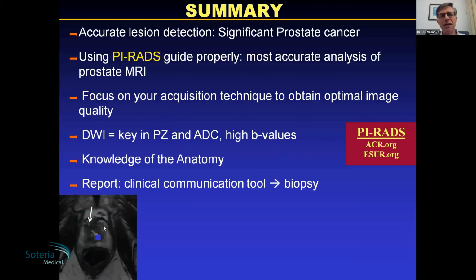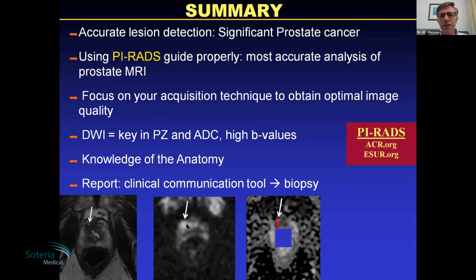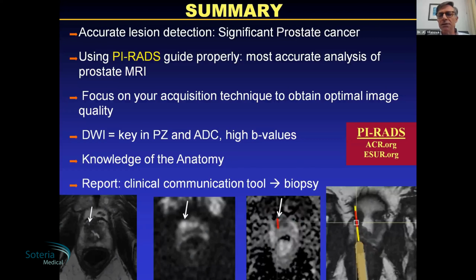This patient had a previous adenomectomy 5 years ago. Two years ago, the patient had 2 different negative biopsies, and now has a rising PSA, T2 not quite as specific, but very, very high restricted diffusion. Then I plan the biopsy. I know that I should guide the needle to this specific location. One needle, one sample, is enough for a Gleason 4+3 in this third biopsy, but a target biopsy in the specific patient.